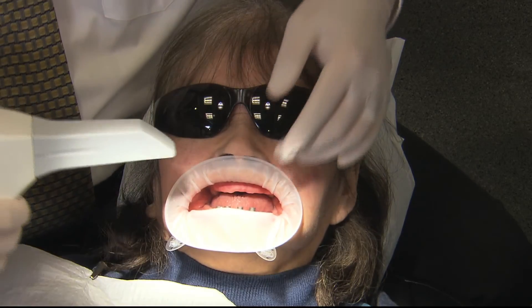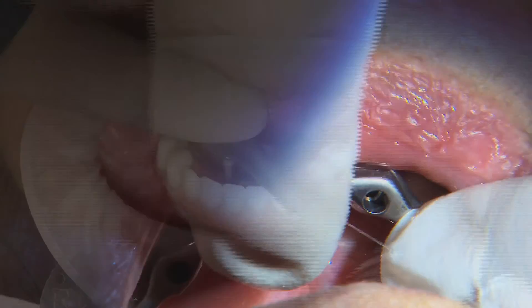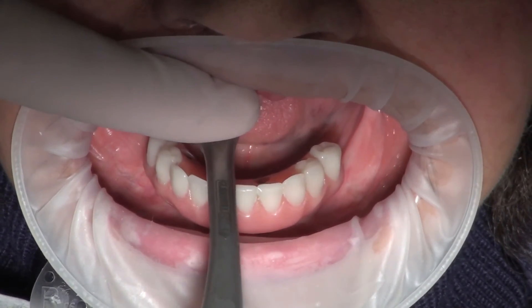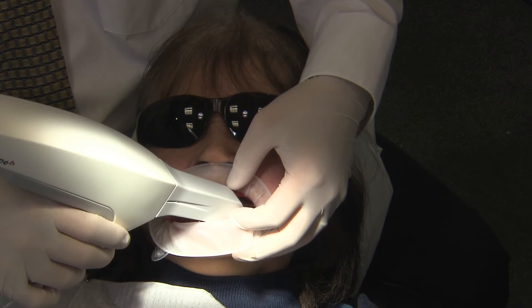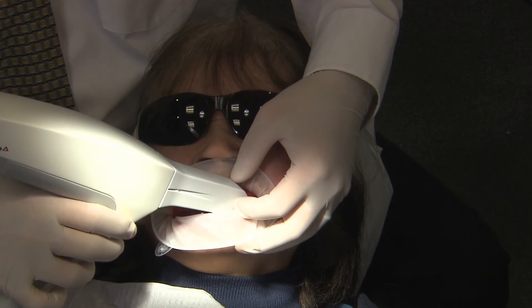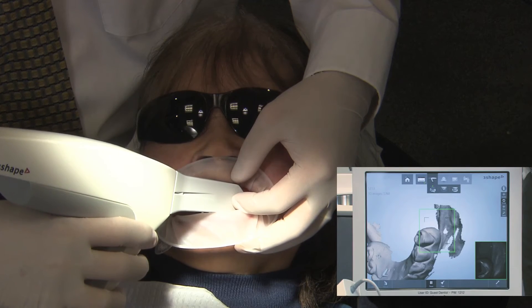Digital impressions were taken with an intraoral scanner at the first appointment. The second appointment was for try-in of the combined denture setup and milled titanium bar. A scan was taken of the provisional in the mouth, taking care to capture adjacent anatomical landmarks.